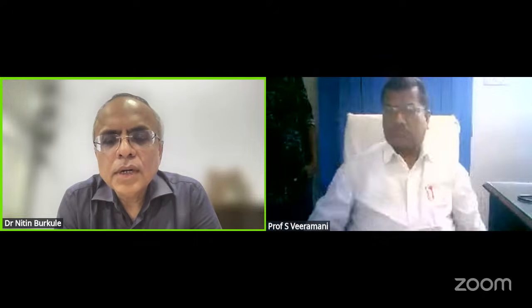So that was related to the temporal and the spatial resolution on a CT scan, and you can see that it's quite a complex technology, and it is continuously evolving. With the photon counting CTs, the CT coronary angio resolution is now almost rivaling the cath angio because it has come down to almost 0.2 millimeters. So I think probably the future is for the photon counting CT. Currently they are quite expensive, but as time goes, they will become more ubiquitous.